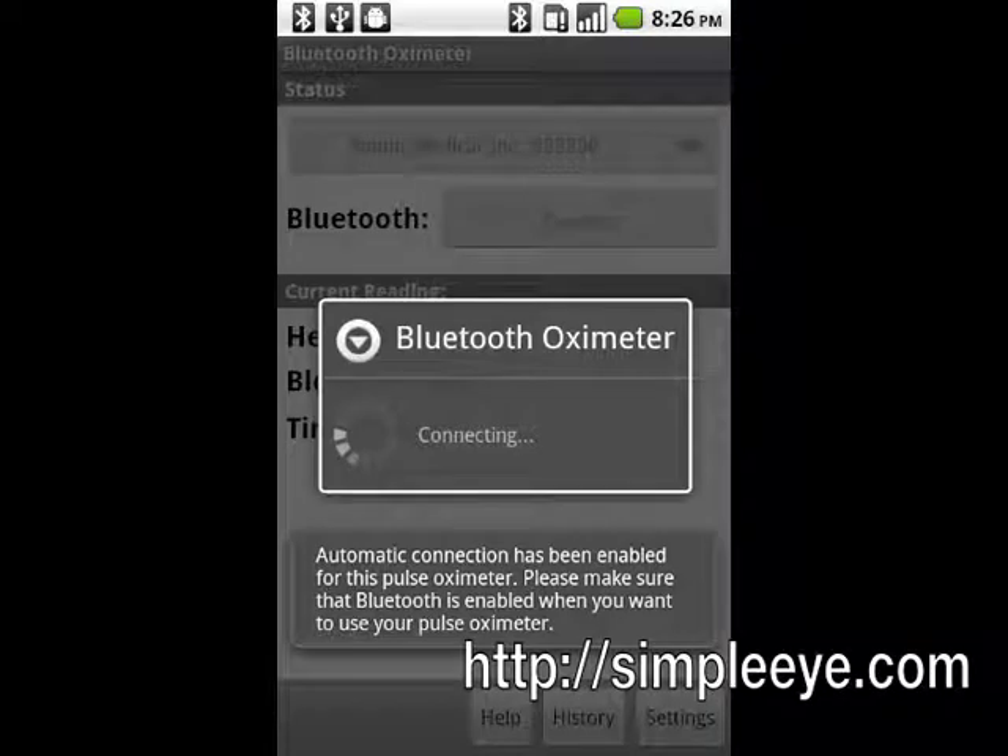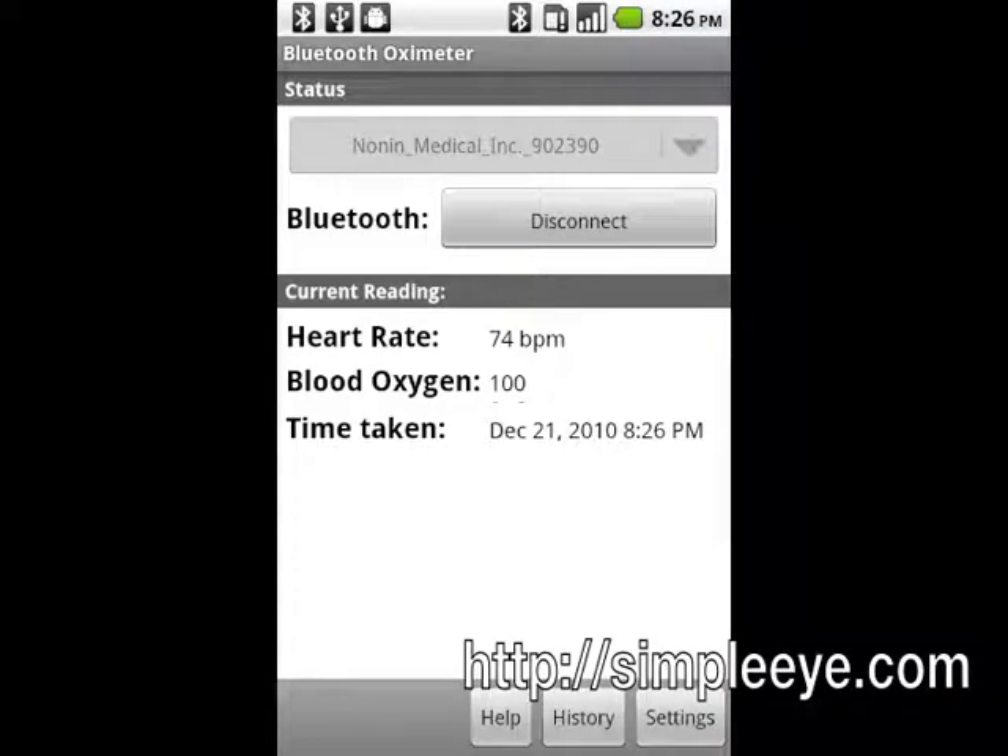Once the connection is established and a measurement is available, the pulse oximeter will send it to your Android device and it will be shown on the screen. The phone will vibrate when a measurement is received. You can tap Disconnect to close the connection.